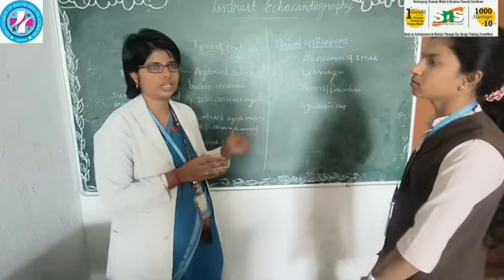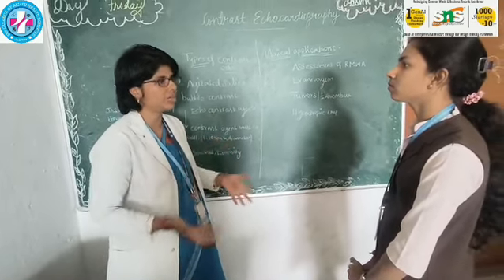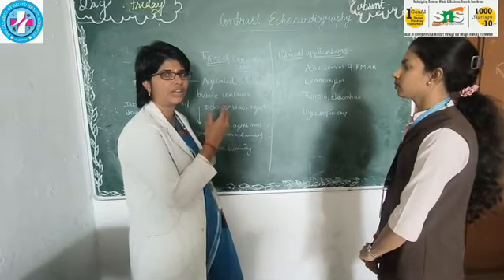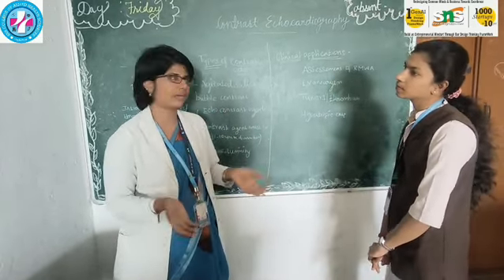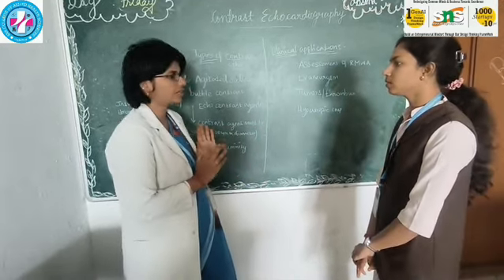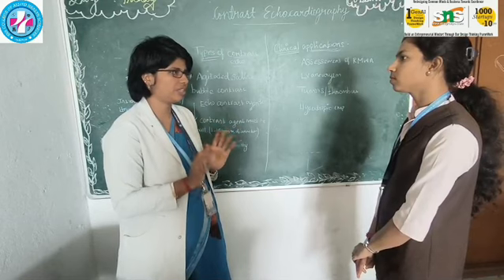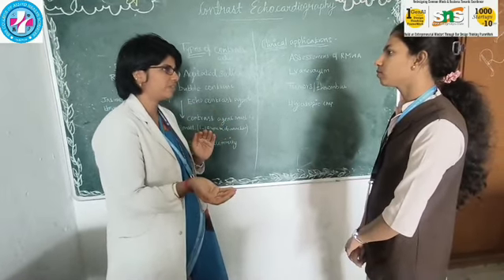Okay, contrast agents are not preferred because sometimes a pregnant woman is also suggested for contrast echo. If we give such agents, it will affect the baby and also the mother. So for that complication or risk factor we avoid contrast agents like Sonazoid or Luminity. Okay, now we are using normal saline. So normal saline infused with 0.5 ml of air.